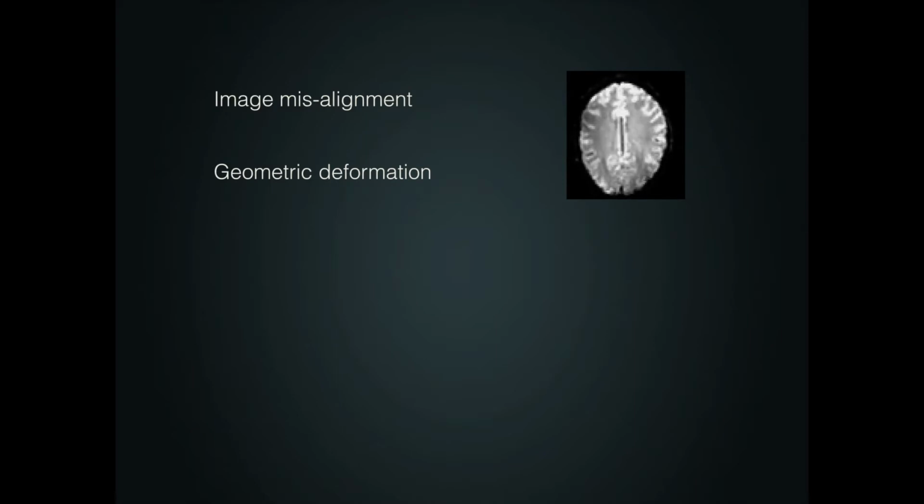Because data is acquired in sequential slices of the brain, which takes a given length of time, which is equal to the TR, if a subject moves during this time, the next image, representing the next time point, will be displaced in space. And there are lots of effective rigid body and non-rigid body image realignment algorithms in the literature for realigning these images. So unless the movement is very large, this is actually a reasonably simple problem to solve.